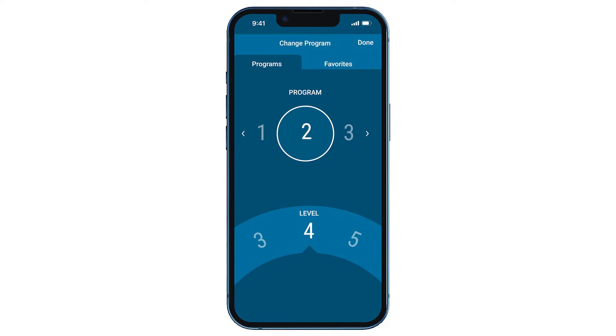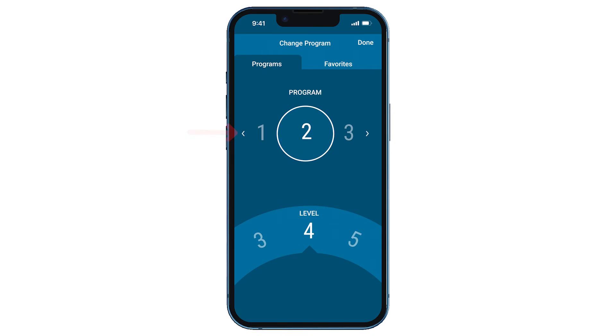To change stimulation, slide your finger to the desired level along the bottom of your screen. If you are instructed by your Nevro HFX care team to change programs, you can move to a new program by tapping the arrow until you see the recommended program. When you have made all adjustments needed, tap Done and the changes will be saved.